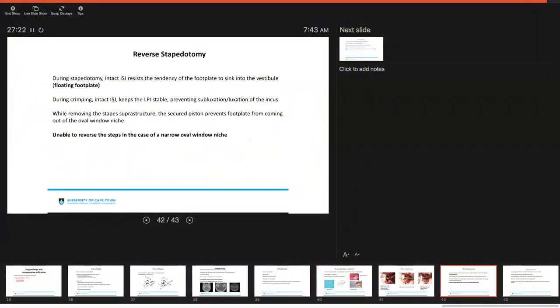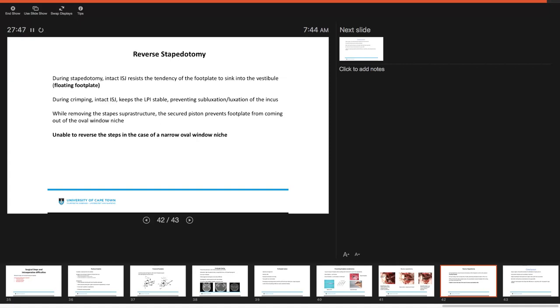So during stapedotomy, for reverse stapedotomy, your intact IS joint resists the tendency of the footplate to sink into the vestibule, creating a floating footplate. During crimping, your intact joint keeps the long process of the incus stable, preventing subluxation of the incus. While you remove the stapes superstructure, the secured piston actually prevents the footplate from coming out of the oval window niche. The one thing to note is that you are unable to do reverse stapedotomy if you have a very, very narrow oval window niche.